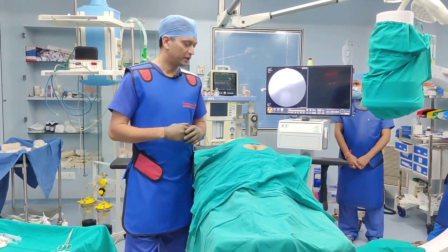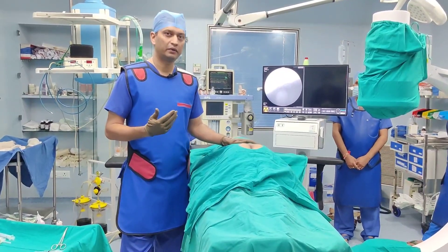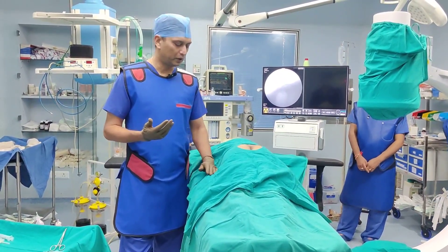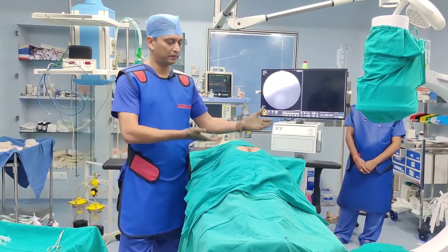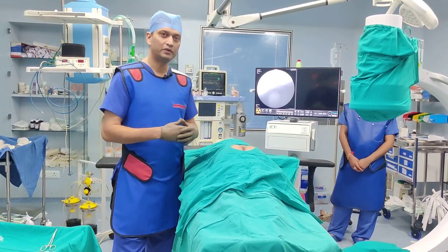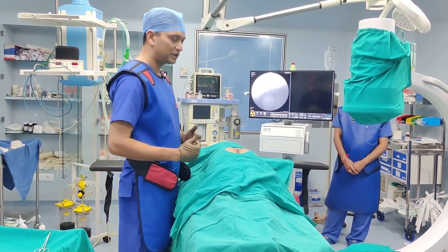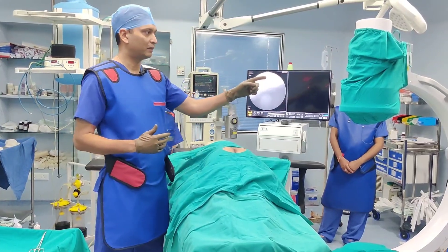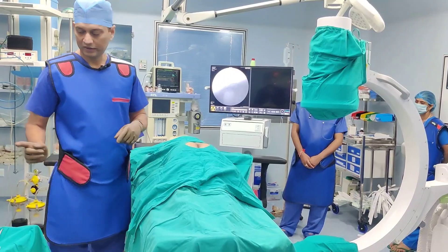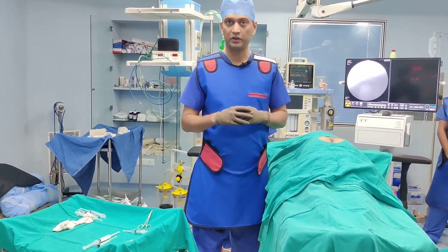This procedure is done with the patient in prone position. We are going to do it under local anesthetic, but you can also do it under sedation. The patient is prone and we have put a pillow underneath so that the buttock becomes more prominent, giving good access during the procedure and when taking imaging. I will be standing on one side, with the C-arm coming from the opposite side and the C-arm screen right in front. This is my trolley.